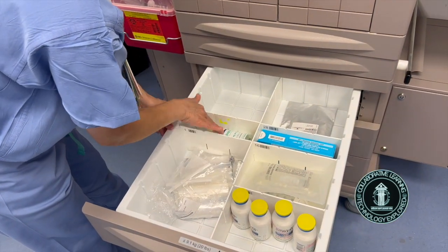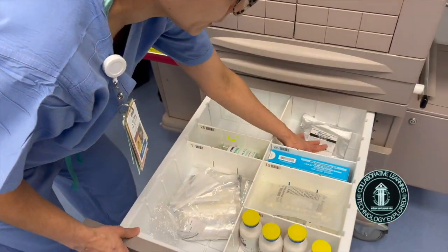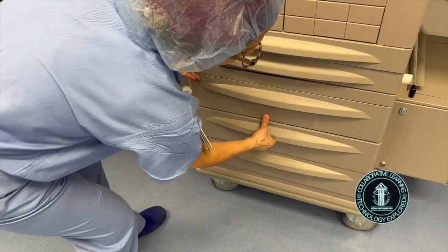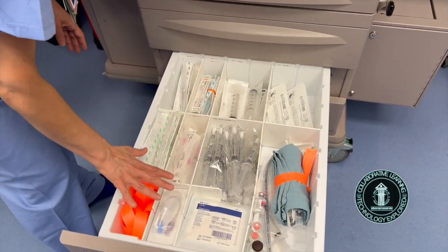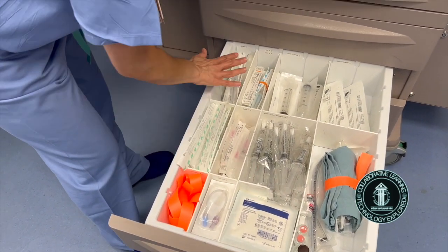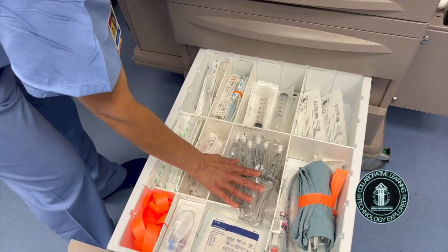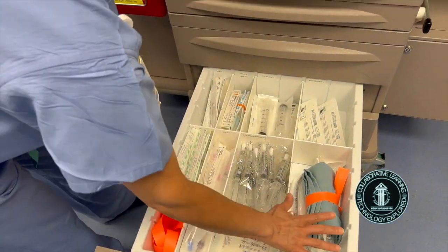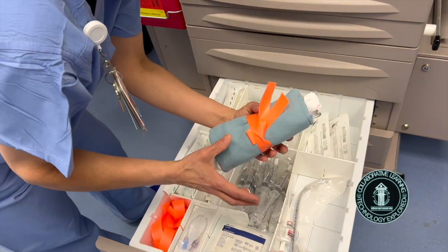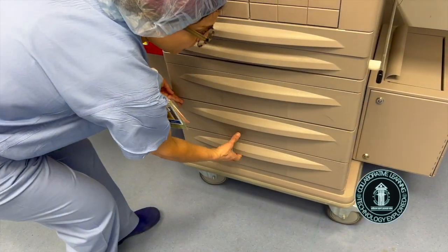Additional supply medications that will be available include dextrose, nitroglycerin, more vasopressors. Here we have milrinone. And we also use these to store additional supplies like IV supplies, like different sizes for IV access, pre-packed sterile saline flushes, IV tubing, and sometimes this drawer is used to have like an emergency IV kit ready to start an IV.